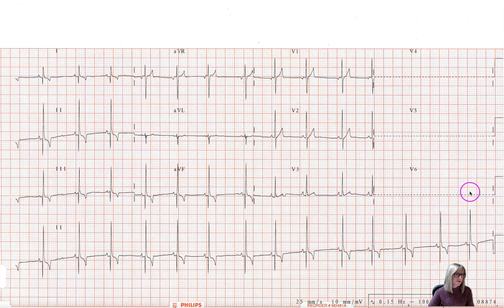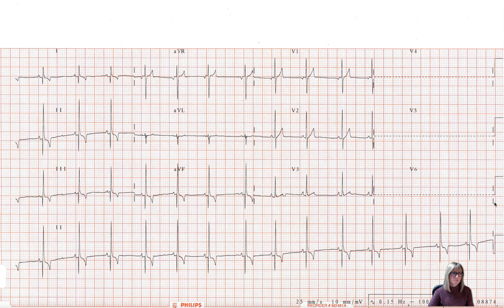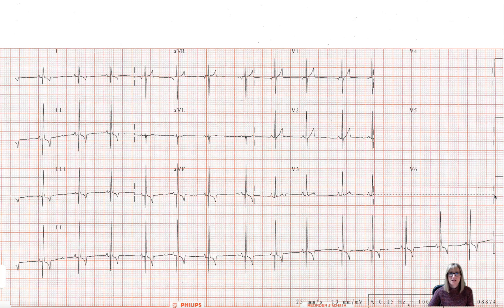The other way we know that is by looking over here on the right hand side at something called the calibration pulse. This vertical line is 10 millimeters tall, which is essentially telling us the same information: 10 millimeters is equal to one millivolt.